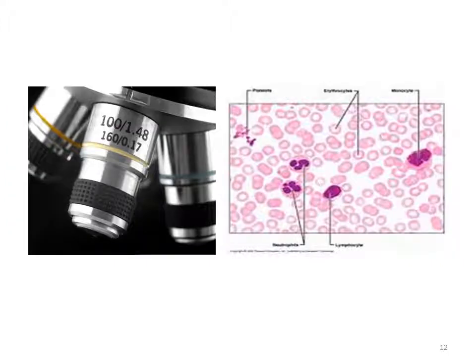Next, switch your lens to the high power or 100-power objective. The overall goal is to confirm white blood cells, scan for red blood cell morphology, scan for platelet morphology, and perform a platelet estimate. Notice how large the cells appear in the slides on the right.